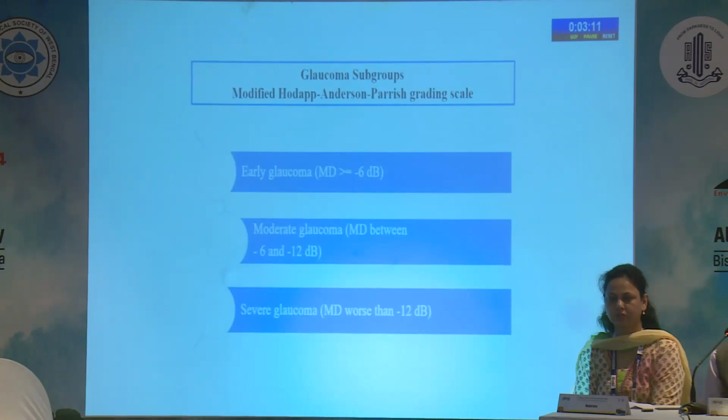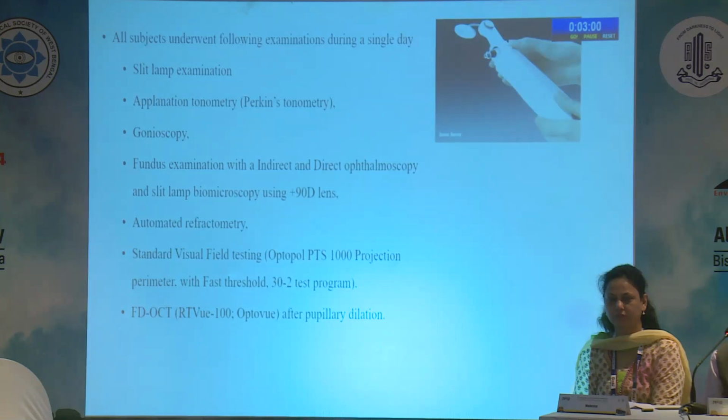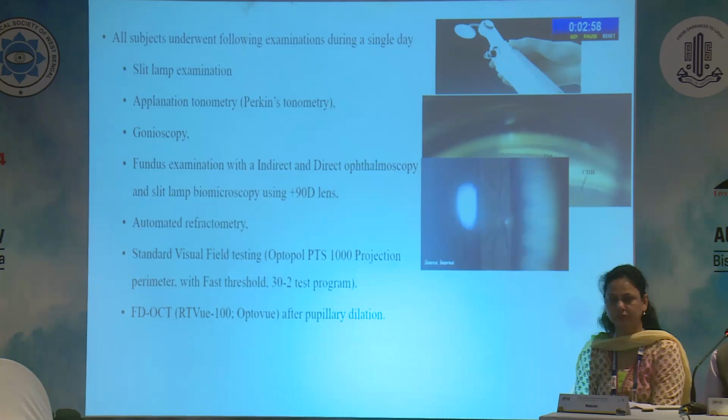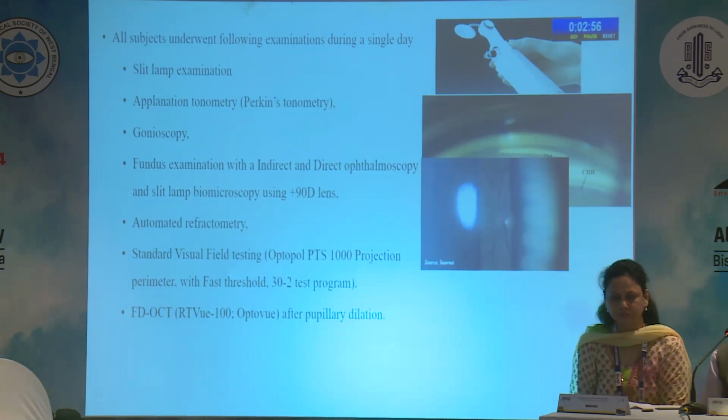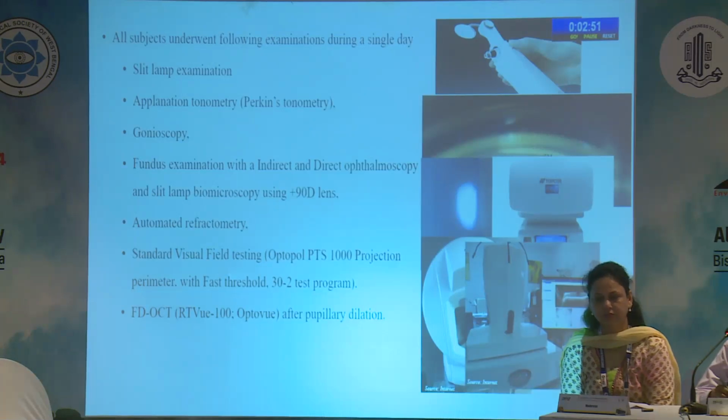Further, they were classified according to the modified Hodapp-Anderson-Parrish grading scale into early, moderate, and severe glaucoma. All subjects underwent the following examinations during a single day: slit lamp examination, applanation tonometry using Perkins tonometer, gonioscopy, fundus examination with indirect, direct, and slit lamp biomicroscopy using 90D, automated refractometry, standard visual field testing, and FD-OCT after pupillary dilatation.